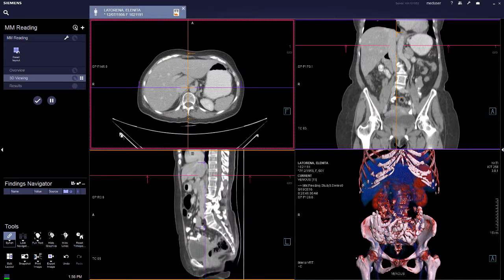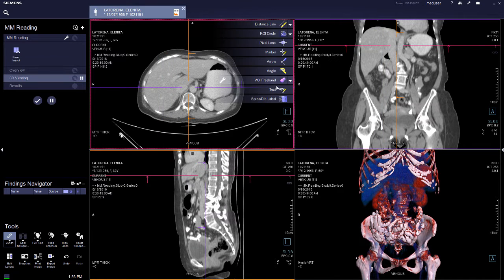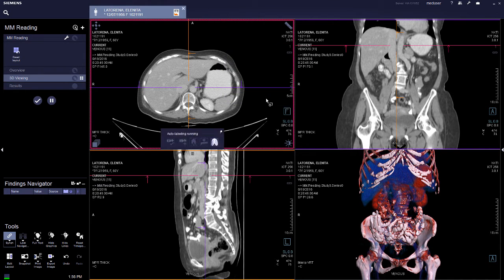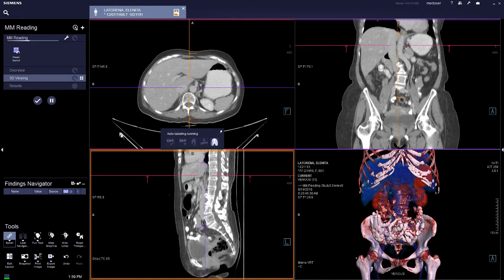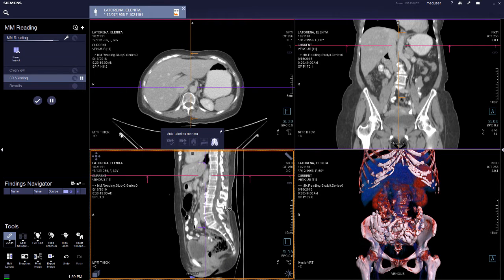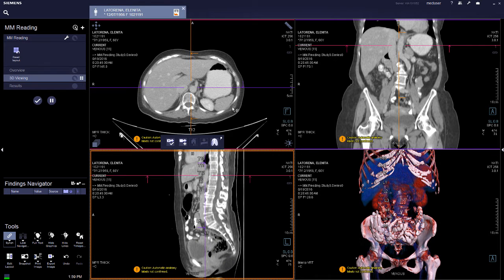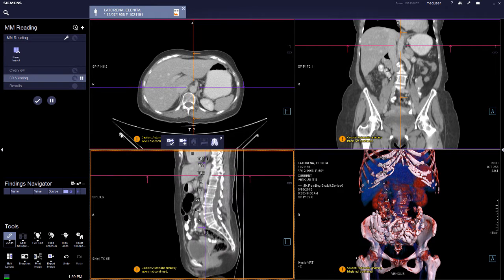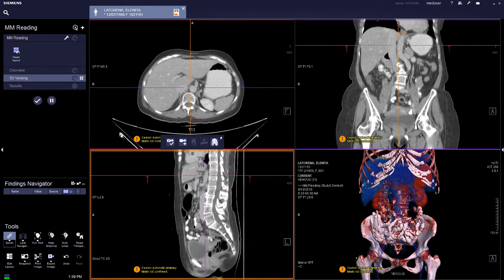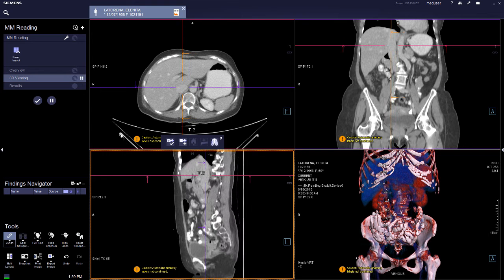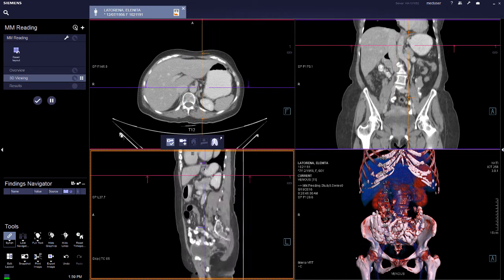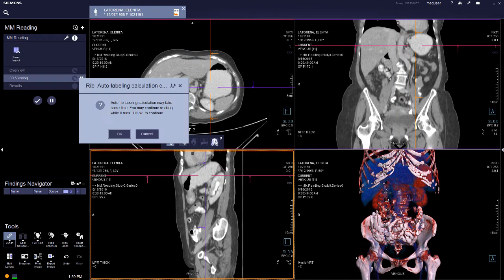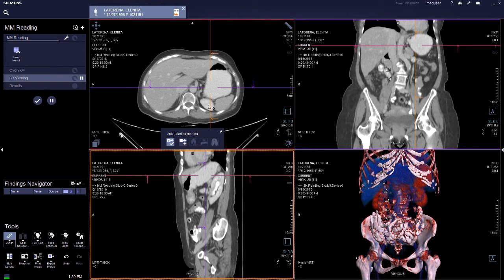For MN reading, there is the spine and rib labeling tool, which is only available in the MN reading workflow. You can have the machine auto-run the spine and rib labeling — it is only recommended for adults 18 years and older. Once the computer finishes processing, check the images to verify correct labeling, confirm the spine labeling, and then run the rib labeling, which takes about one to two minutes.